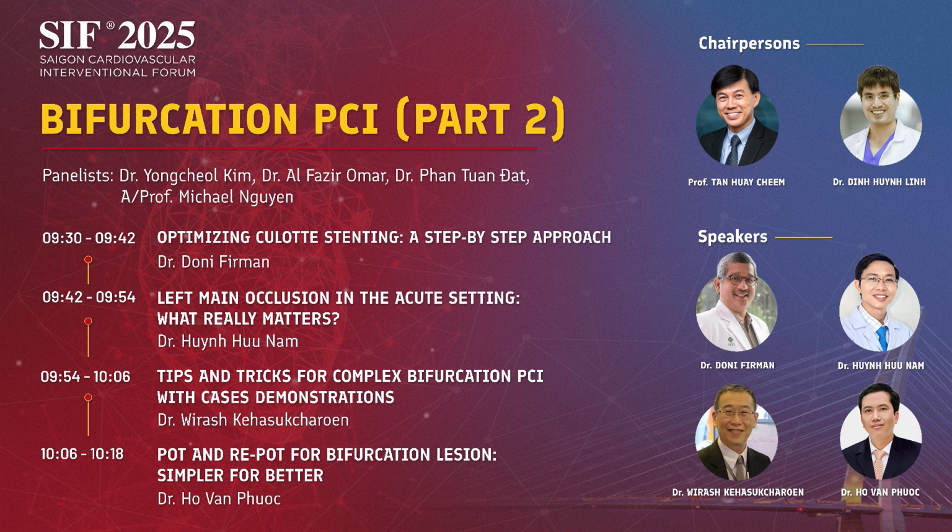You mean that after you put a stent? After we put the stent. Yeah, yes. I think in the situation of a very difficult side branch, you have to think of the modification of this side branch ostium before putting a stent. Otherwise, to rewire across this difficult side branch after stenting is nearly impossible. So sometimes I try to modify first.